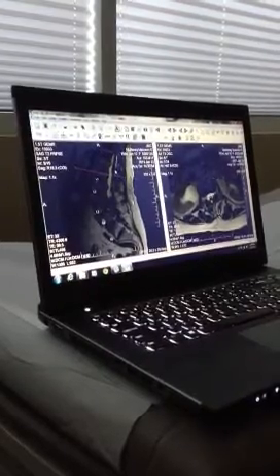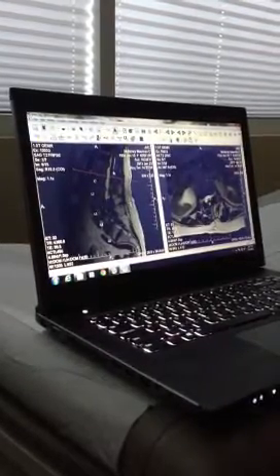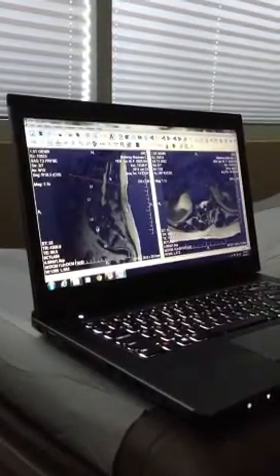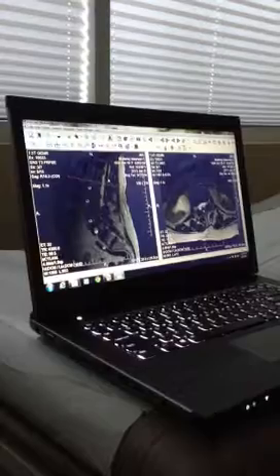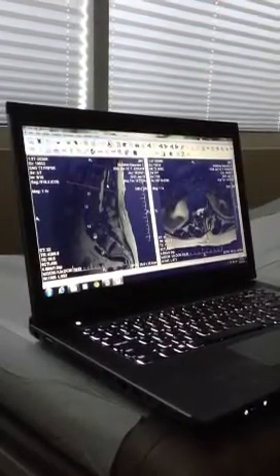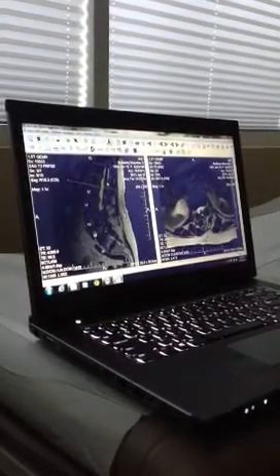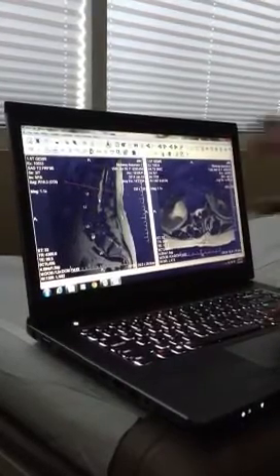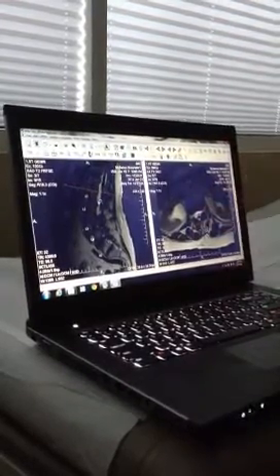Every time you go over a speed bump in your car, or you're going jogging, or you're walking briskly, your spinal cord has very small motions back and forth. And that fluid is to protect it, but also supply it with some nutrients, okay? So, that's what that white is, okay? This is a T2 weighted image.